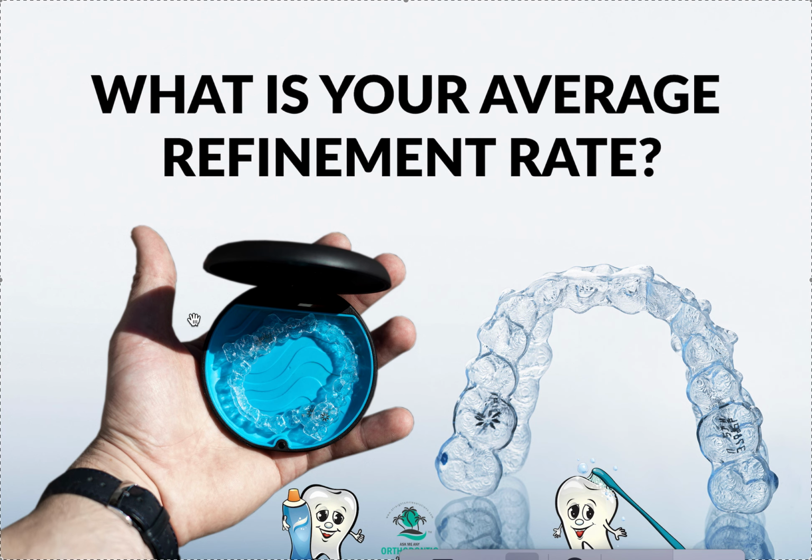You want to make sure that your patients get the thumbs up or thumbs down and they don't progress on to their next aligner unless there's 100% tracking. I like to double check the tracking, slightly open, front, side, to make sure it's all 100% seated. If it's not, I'm going to ask them to try their previous aligner. If that's still not fitting, try the previous aligner before that. Make sure they're saving all their old aligners, right?